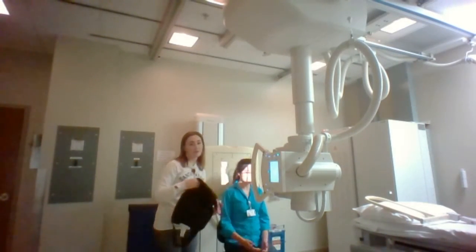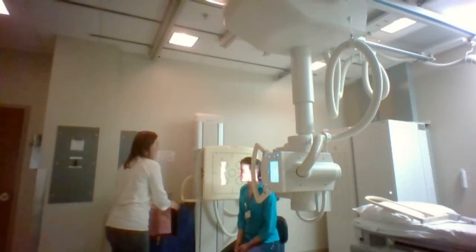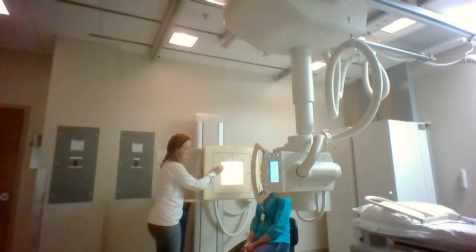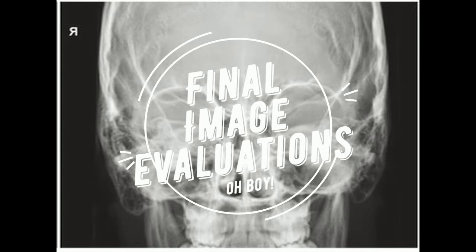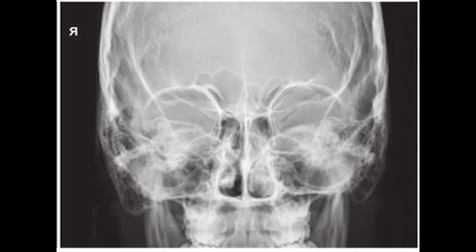So those would be all the projections needed for the sinus exam. To begin, I will start by evaluating the PA axial projection, or the Caldwell method.